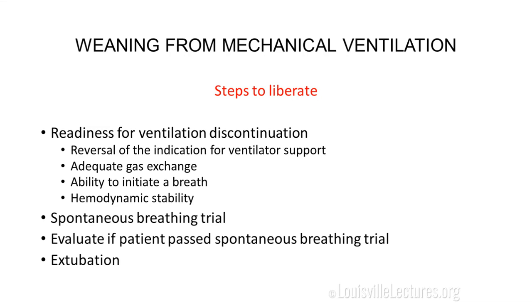You got to ask about if there is adequate gas exchange. You got to make sure the patient has ability to initiate a breath. And you got to make sure the patient is hemodynamically stable. So that goes into readiness for ventilation discontinuation. Then you go into a spontaneous breathing trial. Then you evaluate if the patient passed the spontaneous breathing trial, and you go ahead and extubate if that's the case.